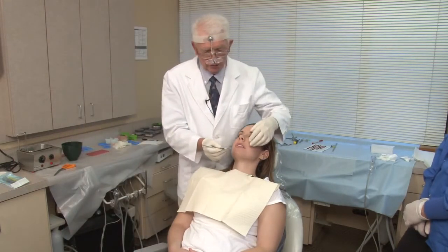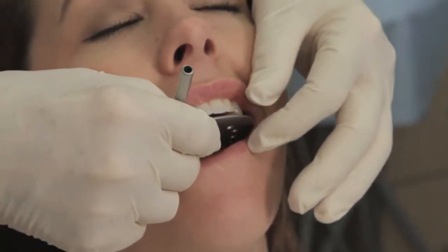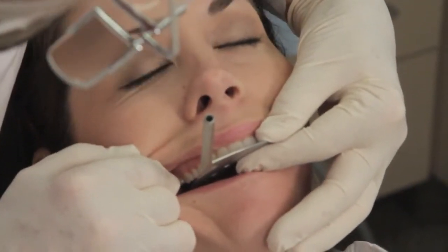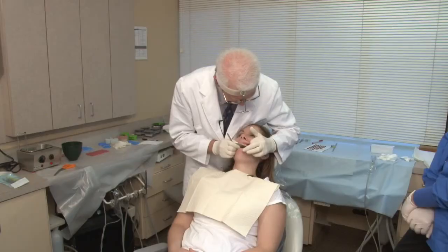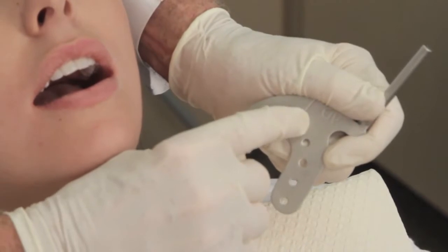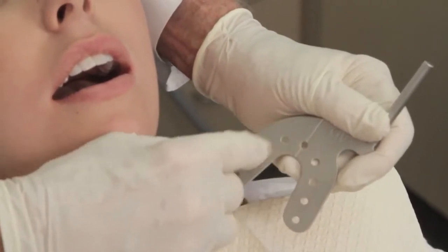And so to determine where I want to place my bite tab, my AccuBites, rotate it like this, set the midline of the bite fork on the midline of the teeth, and look and see where the first molars are on both sides. And then I know that I can place my first molars here at this hole, and my anterior bite in about this area here. So that's the way I would determine how and where to place my AccuBites.